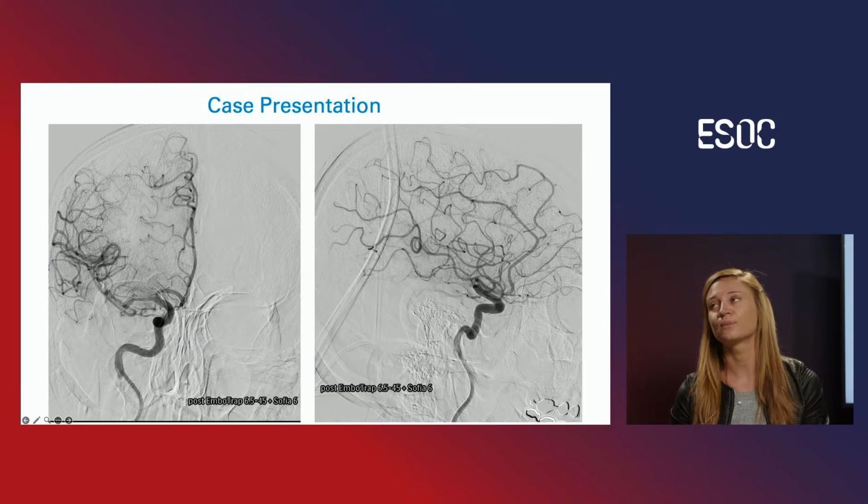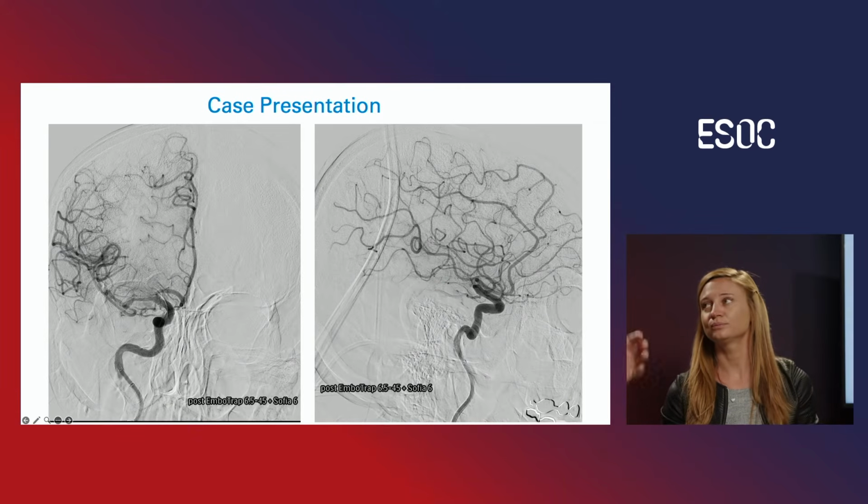Yeah, so if you take out the stent retriever through the balloon guide, you keep a hand on the balloon guide to pull it back. Always. If it's going up? Always. So keep control on the balloon guide. Always do that, to not do the anchor maneuver again for the next maneuver.